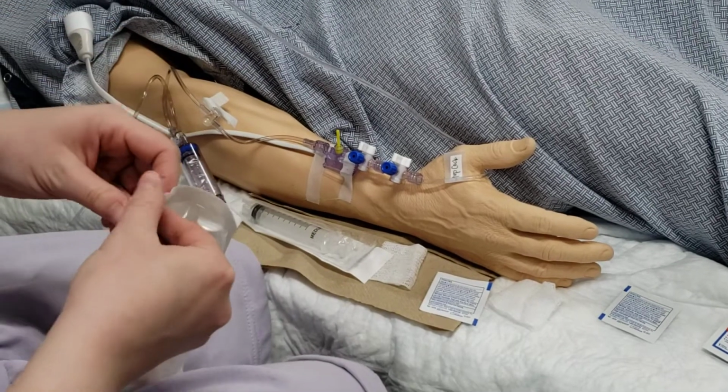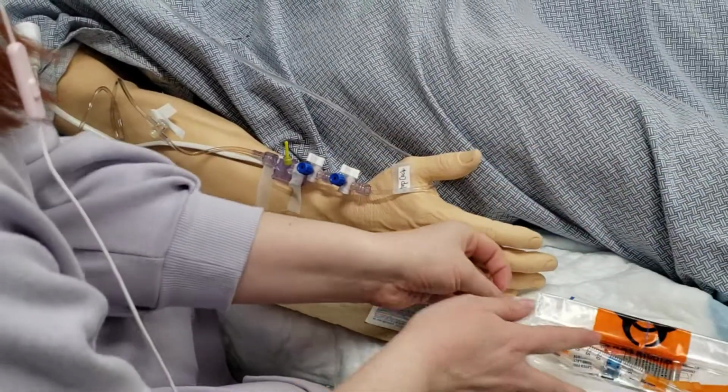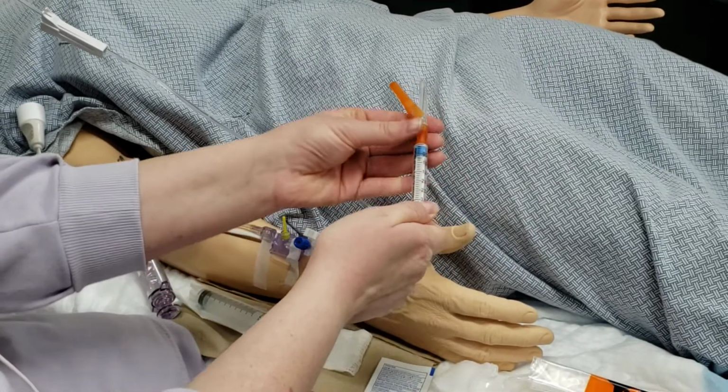Maybe. Prep our blood gas kit. Close it.